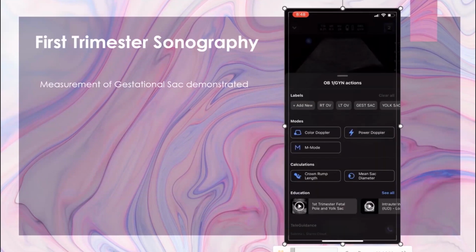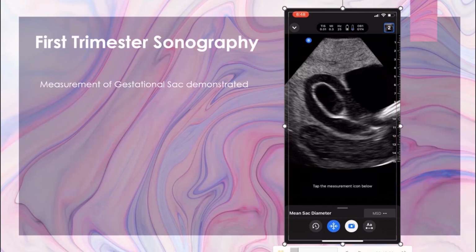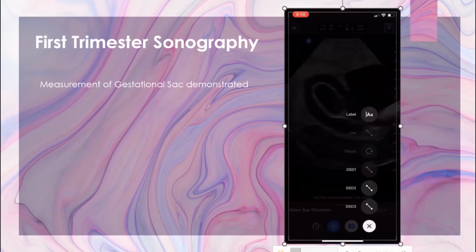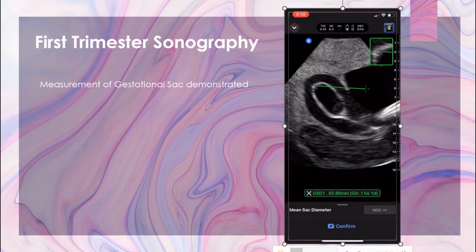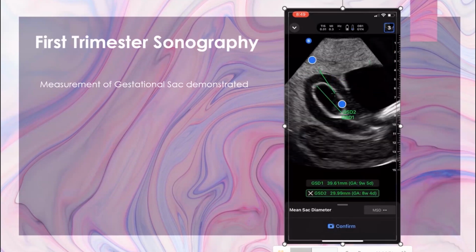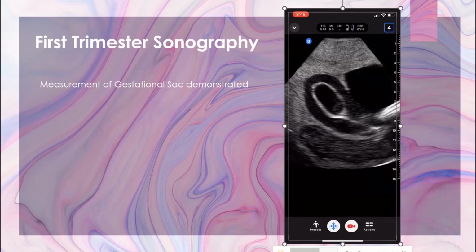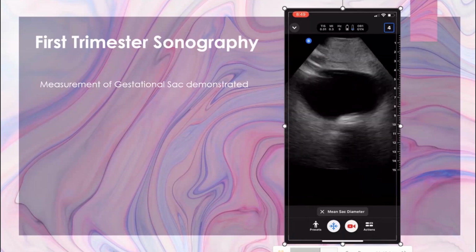And I think you can see you do have to select what measurement you're going for with this particular probe, and that's pretty common. But you can see I was angling around to make sure I got the full length. I'm placing my caliper at the border of the wall, measuring the fluid only and not the wall. And I am using my package. It's gestational sac diameter 1, 2, 3. If you don't get this right, the measurements will be off. But there's always deleting measurements and re-entering, whichever diameter you messed up. It's completely normal.